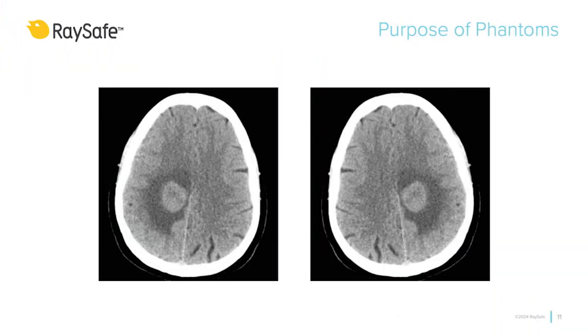Imagine if a machine hasn't been properly tested and it produces a mirrored image showing the left as the right side. This simple mistake could lead to serious consequences. If a radiologist mistakes one side for the other, they might diagnose or treat the wrong area. For instance, if a tumor appears on the left side, but the image shows it on the right, the treatment could be misdirected, potentially harming the patient and delaying the correct treatment. That's awful thoughts. We have all heard about patients getting the wrong foot amputated or things like that. So you must surely have the right tools to understand left and right.